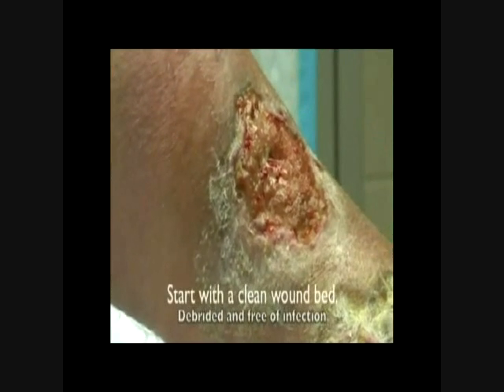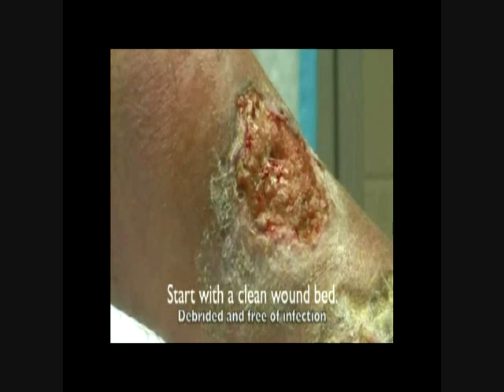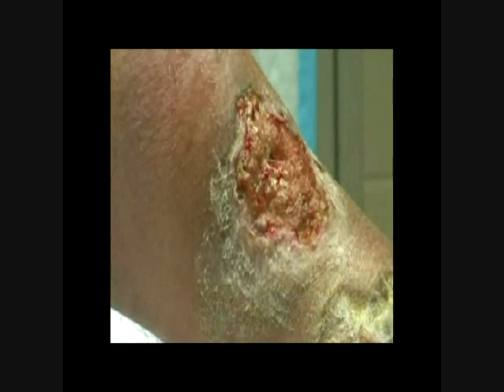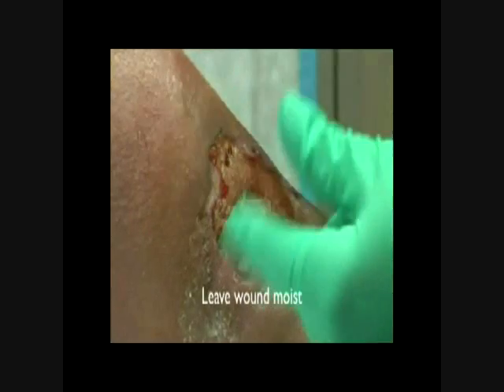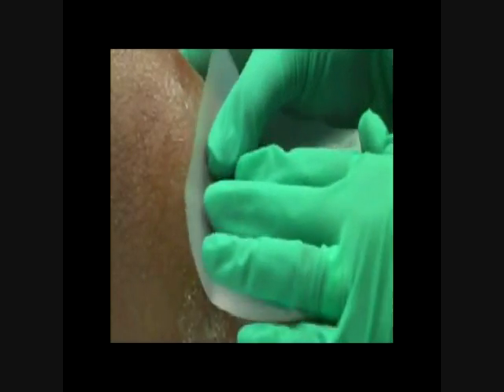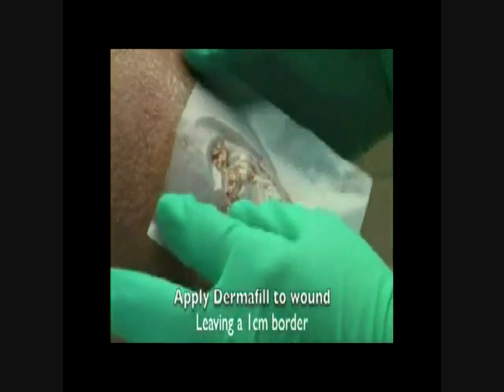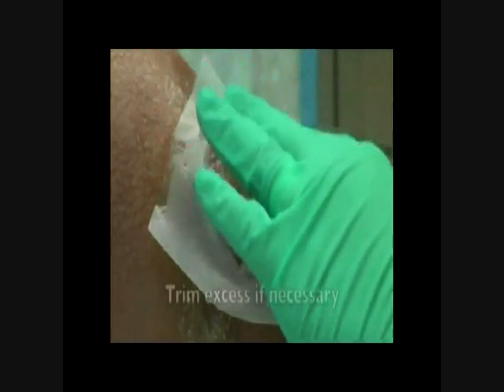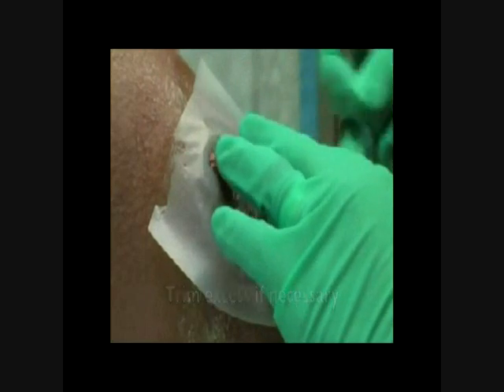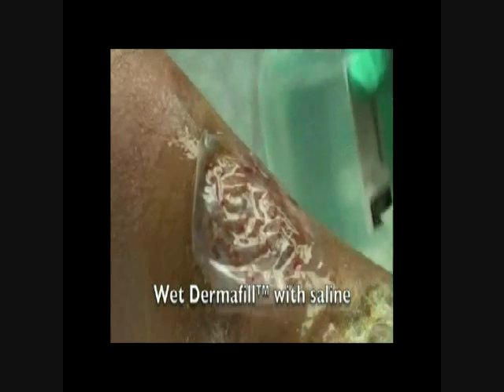It is crucial to start with a clean wound bed that is free of infection and debrided if necessary. The wound should be left moist prior to applying the Dermafill dressing. Cut Dermafill to the wound size, leaving a 1 cm border. Once Dermafill adheres to the wound bed, you may trim any excess. It is imperative to completely saturate Dermafill with sterile saline. This allows for moist wound healing.